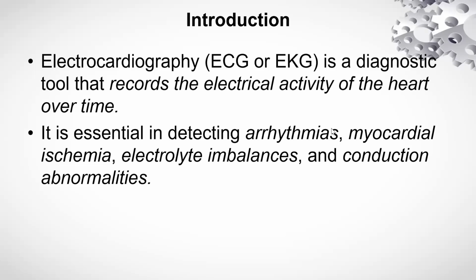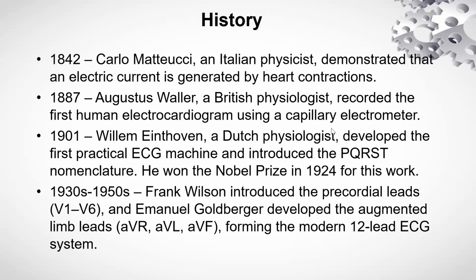Okay, so ECG is essential in detecting arrhythmias, myocardial ischemia, infarction. It's also very useful in detecting common electrolyte imbalances, and you can also use it to detect conduction abnormalities. All right, so ECG has come a long way.